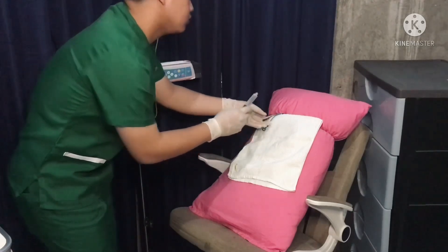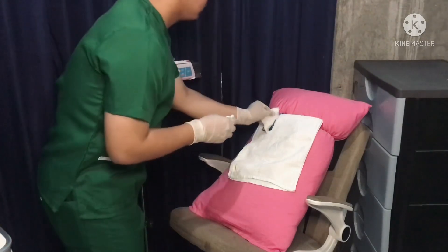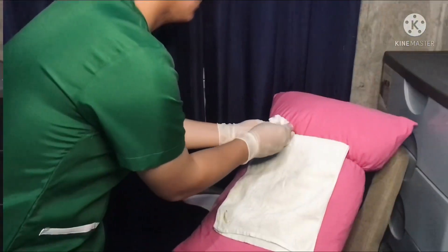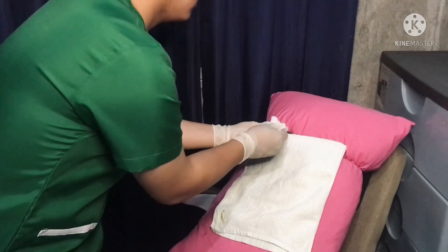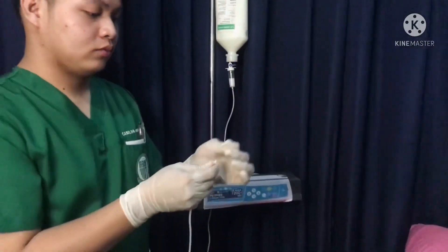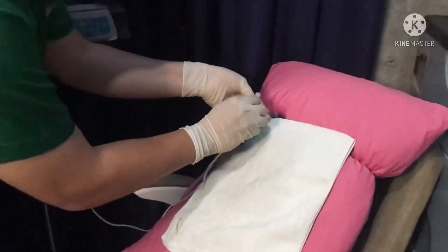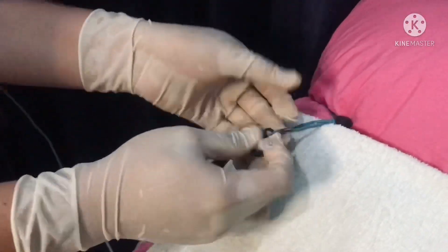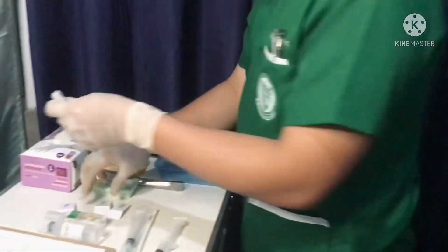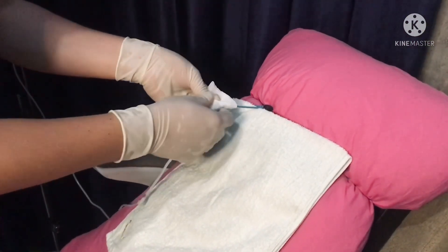To prevent air from entering the line, the clamp should be closed while you are still pushing the syringe. Be careful, however, that the syringe does not disconnect and splash. Scrub the hub again for at least 15 seconds. Connect the TPN and unclamp the central line. Wrap the gauze around the line.